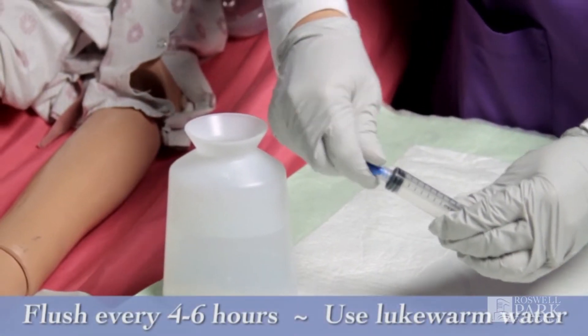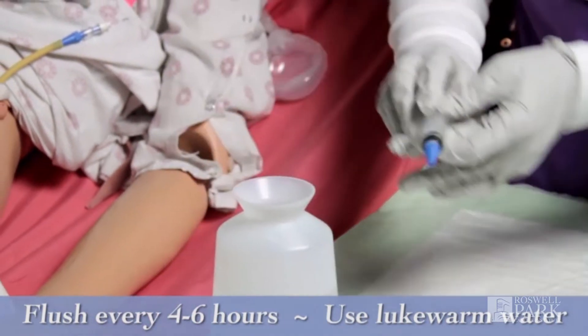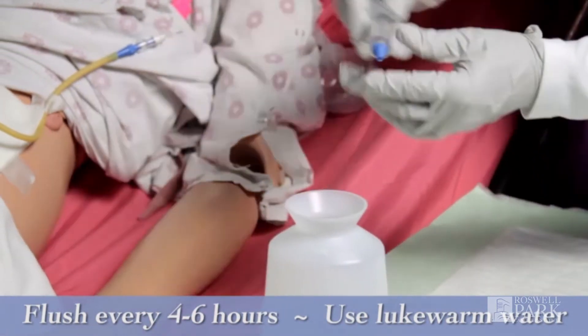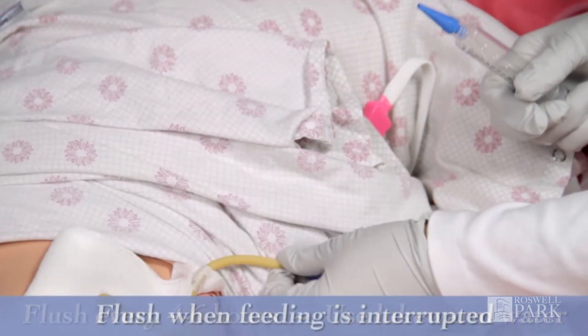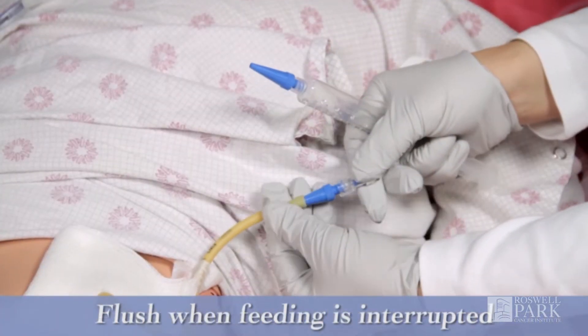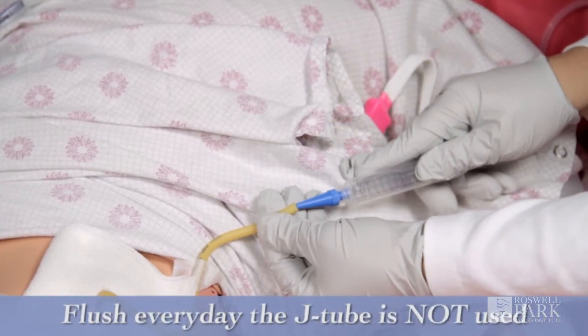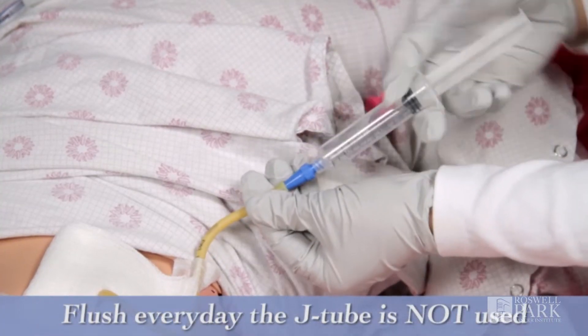Flush every four to six hours if feeding is continuous. To reduce the risk of tube clogs, always use lukewarm water to flush the tube. Flush whenever feeding is interrupted, before and after administering medications, and every day the J-tube does not get used.